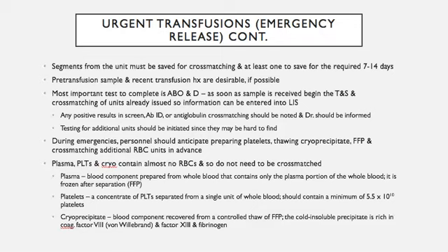Any positive results in the screen, antibody ID, or antiglobulin cross-matching would have to be noted, and the doctor would have to be informed. So again, the patient's already been given that blood, and we're doing the testing that would normally be done prior to that transfusion. We're doing it after the transfusion is already complete or it's underway. So if anything comes up during that testing, we would have to notify the doctor.